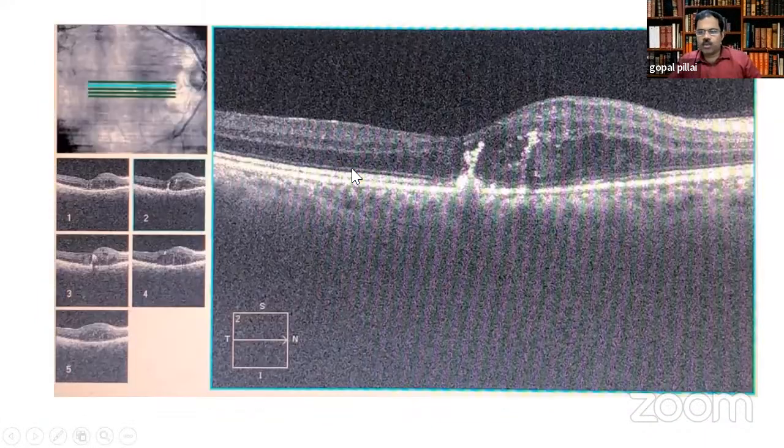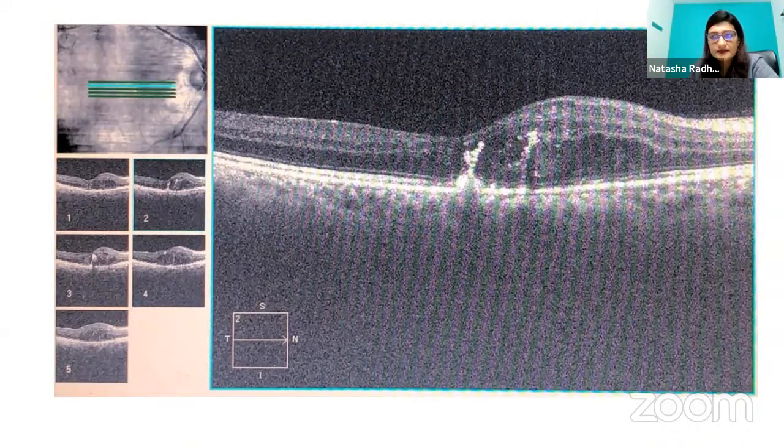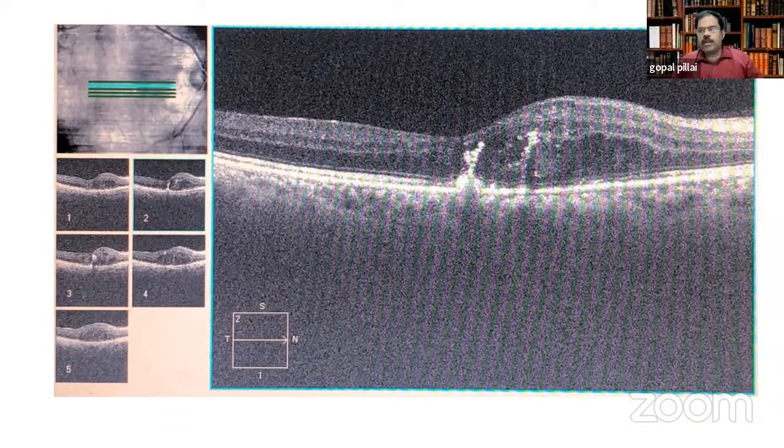How many cases to go? 3-4 more OCTs to be discussed. Okay, fine. Mainly, I think what is left is DR, diabetes, which we haven't covered. Can somebody tell me who is looking at DR?